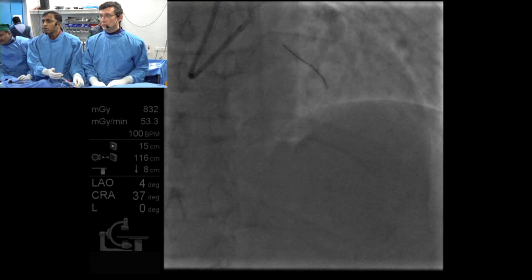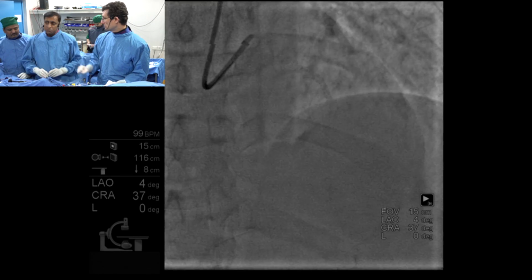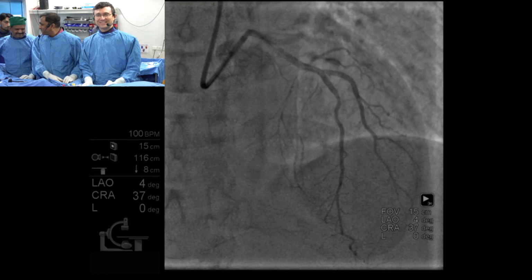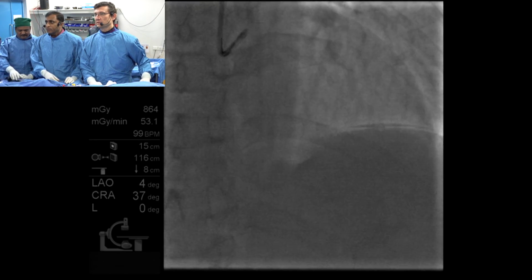Hang on one sec. But Dr. Akasaka, what initially was perceived like 90%, fantastic, is now 80, right? 80 means somewhere here it is 76, somewhere here it is 82, we can leave it alone. Yes, because even in a tapered method, after the big branch, the diameter changes suddenly.